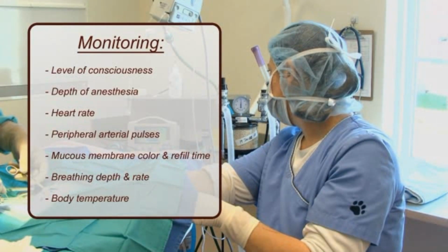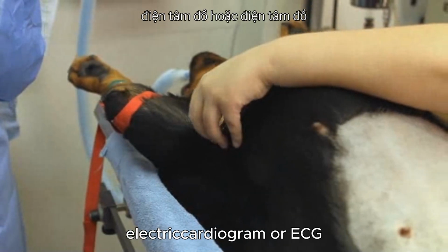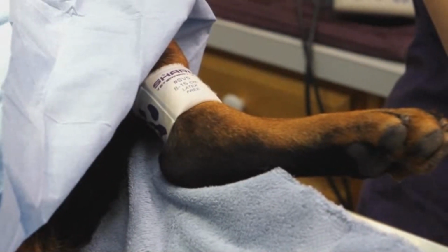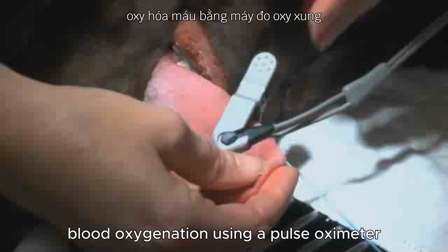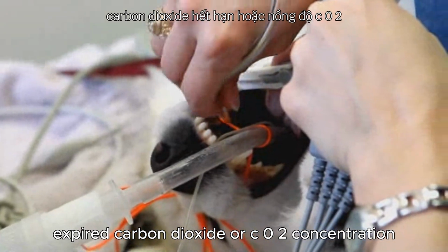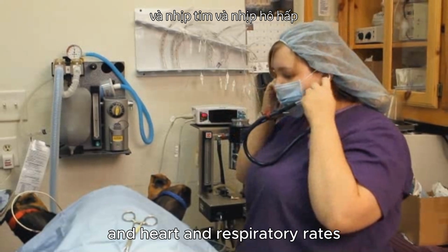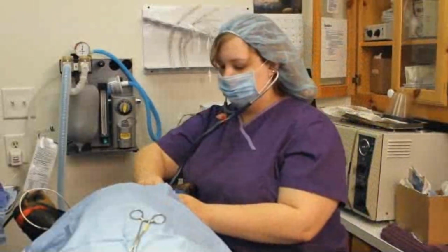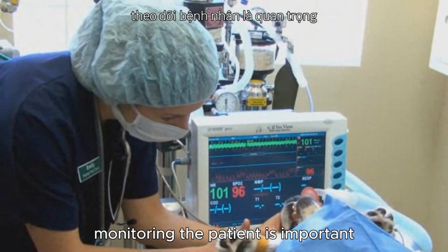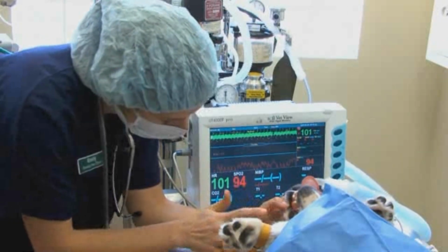body temperature. When the appropriate instruments are available, you may be asked to monitor the patient's electrocardiogram, or ECG, blood pressure, blood oxygenation using a pulse oximeter, expired carbon dioxide or CO2 concentration, body temperature, and heart and respiratory rates. Let's review a few of the monitoring techniques we've just mentioned. Monitoring the patient is important because anesthetic drugs depress the function of the brain, heart, and lungs.